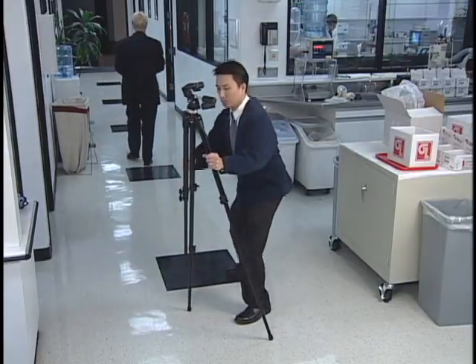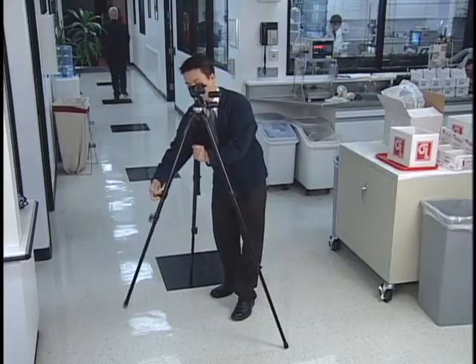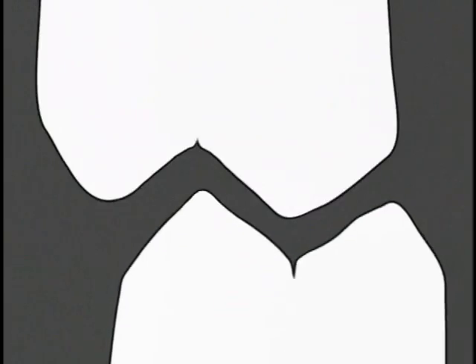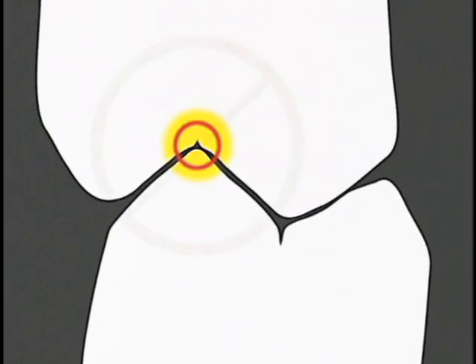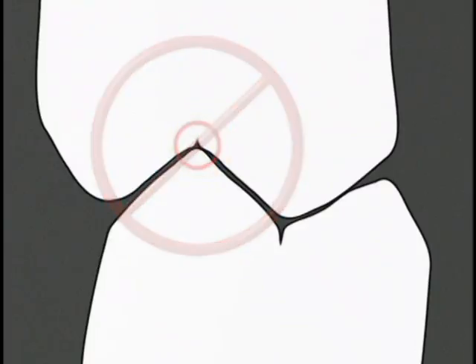If only 2 legs are down, it's not balanced. But as soon as you put the third leg down, it is balanced. You should also be aware that the 3 contact points of the stamp cusp are not going to be in the pit of the fossa, nor at the tip of the cusp. In fact, the tip of the cusp and the pit in the fossa never come into contact. It doesn't happen in natural dentition, and it shouldn't happen on your restorations.